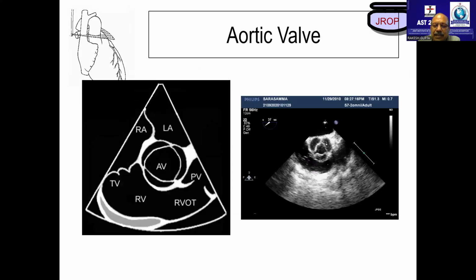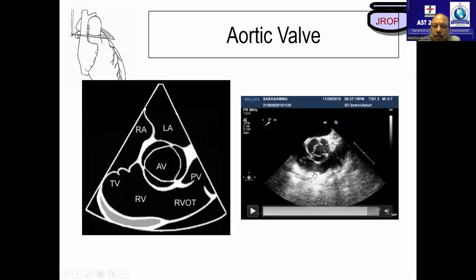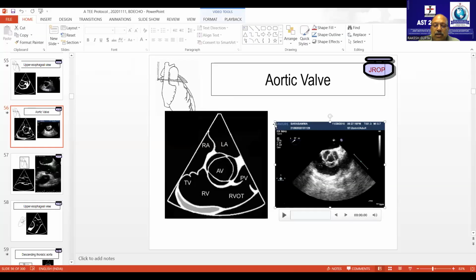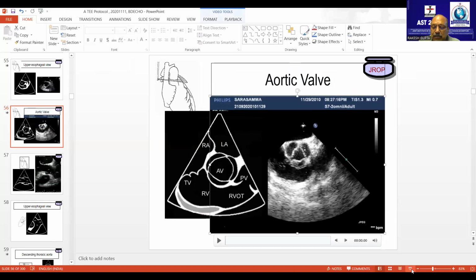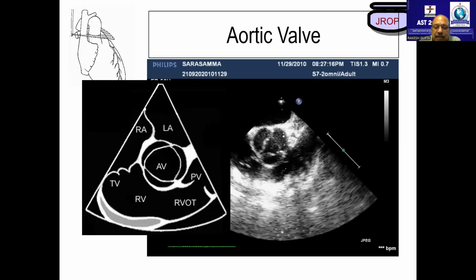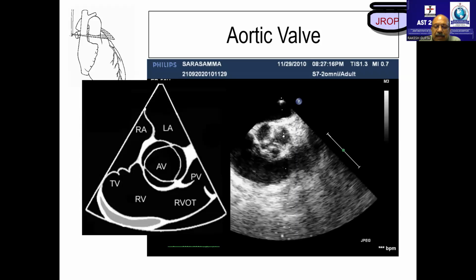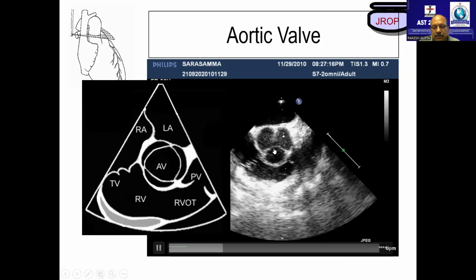Now look at this. Let me just freeze this image for you. Look how beautifully you can see the aortic valve margins in transesophageal echo. Can you? Yes. So whenever we are in doubt, we do not look at other things. We just put a transesophageal probe inside and look at the aortic valve area. And this resolution, this imaging quality is not there in transthoracic echo.